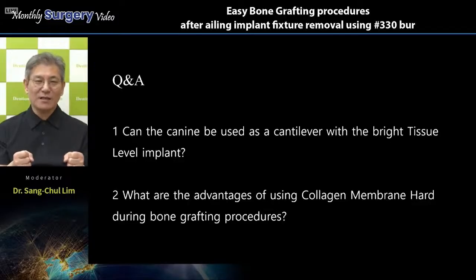The implant mechanics are a little bit different compared to natural dentition. So in some cases, this canine portion can be skipped, right? So finally, my answer is yes, I can. To make a canine a cantilever, especially in an elder patient, as I mentioned before. If these areas are complicated, maybe they should be skipped, and the neighbor areas are enough to make an implant-supported 4 unit bridge.